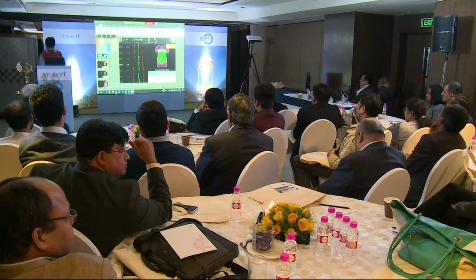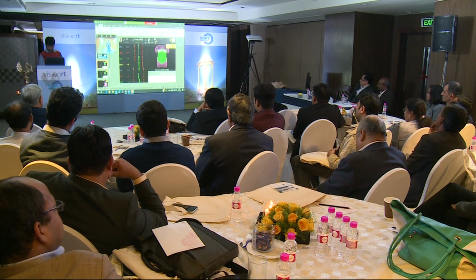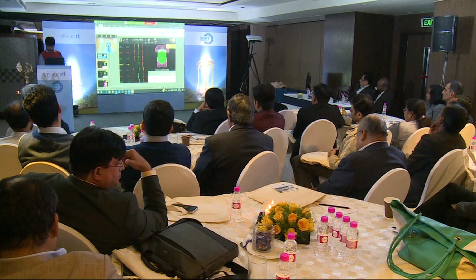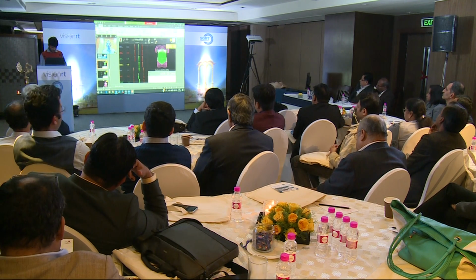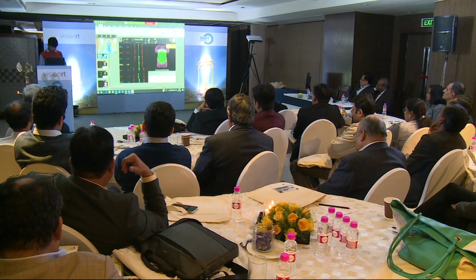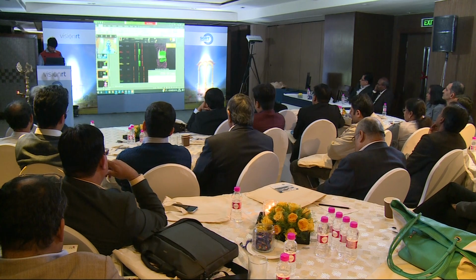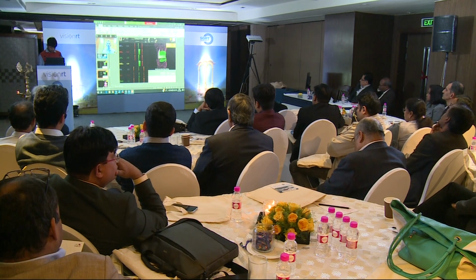And so SGRT allows you to get the posture correct by, first on slide 24, having an upper ROI that frames out the paraortics, but avoids the fleshy abdomen that you can see there in green that's moving with breath. You get a very nice stable signal by having a good ROI. Then moving to slide 25, you see a lower ROI that looks at the pelvis and the side of the patient, and that allows us to adjust the pitch of her pelvis, also avoiding the fleshy abdomen to avoid noisy deltas.